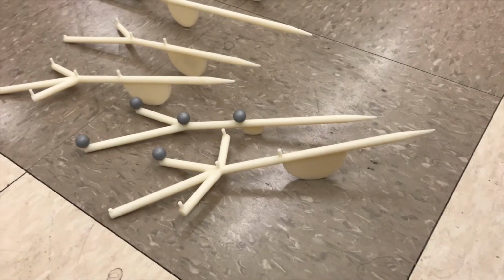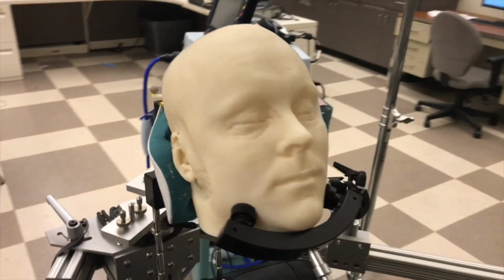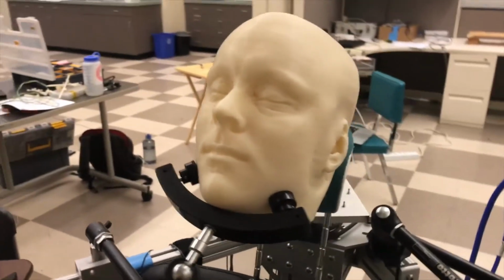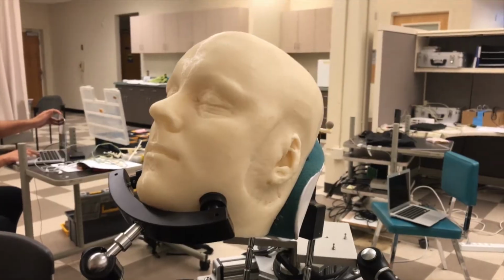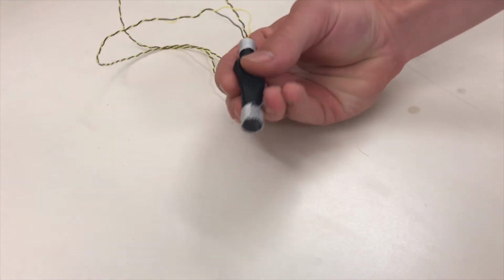Two experiments were run to validate the accuracy of the system. The first investigated the number of reflective markers and the overall length of the tool. This experiment demonstrated that the final tool will track with sufficient accuracy during intended use. The second utilized a 3D printed phantom and a corresponding DICOM set to demonstrate that registration accuracy was within acceptable ranges and was robust to user input errors. An additional prototype was created to investigate user perception of haptic feedback. Using this prototype, the optimal parameters for pulse sequence and amplitude of the haptic feedback were determined.